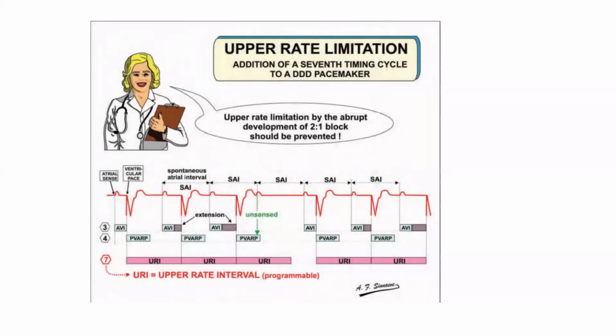What's meant by Wenckebach behavior? The AV delay is gradually prolonged till one beat is missed, and then the following PV interval or AV delay interval is short. What is the significance of this? It is to avoid a sudden 2 to 1 block. But remember, the 2 to 1 block will happen if the rate increases beyond 120. So this is the stage before the 2 to 1 block rate. It will either alarm the patient or make the symptoms less sudden, which may be helpful.